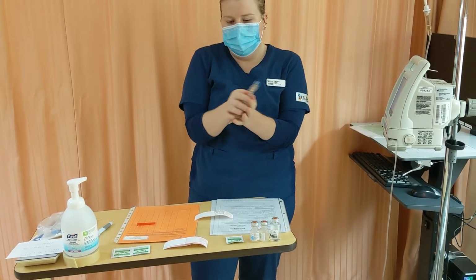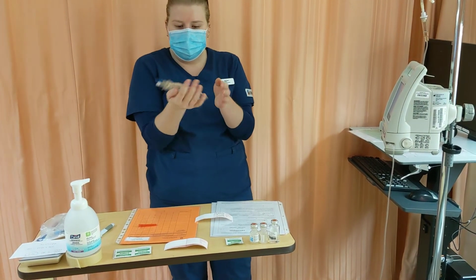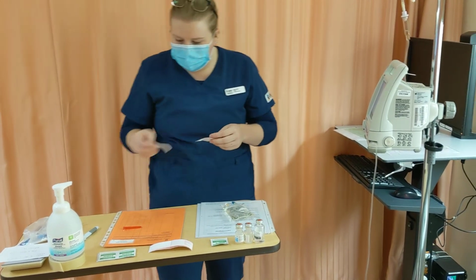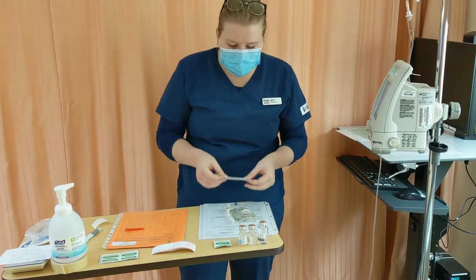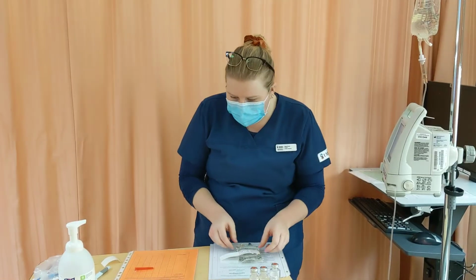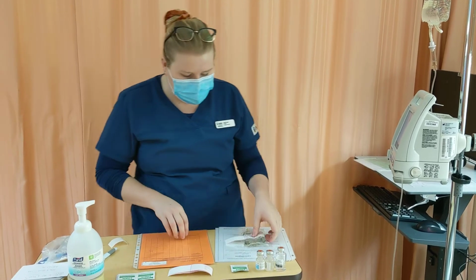I'm just going to lightly rotate this medication, make sure it's fully incorporated. After I know that it's fully incorporated, I'm going to put my label on. I'm going to make sure I put it on the right side that's not blocking any of the information. After I've got my label on, I'm going to gather my supplies to go to the bedside.